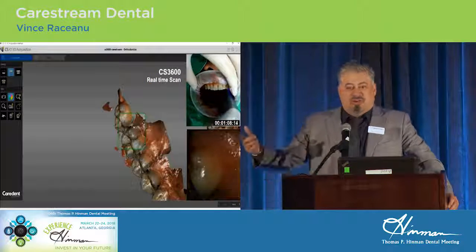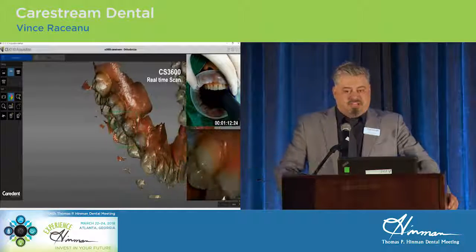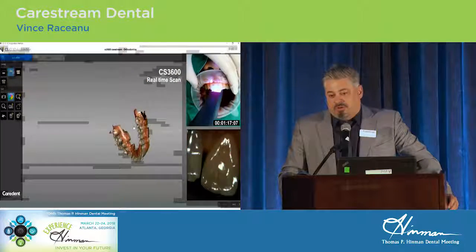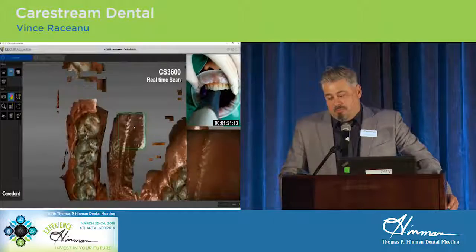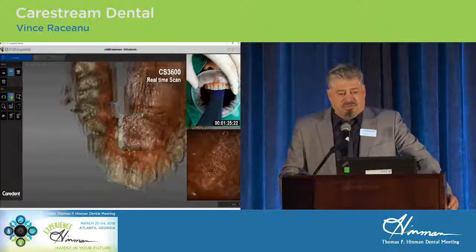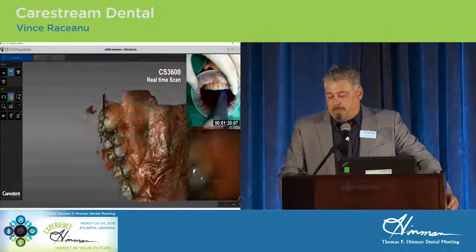So you capture lower, upper, and bite. There are many different ways to scan. You don't always have to do a full arch scan unless it's for an orthodontic type appliance or other multiple units that you're prepping and so on. Palate, of course, if you need ortho. But you can scan for implants, for restorative. We'll talk about all that. There's no limitation as to what it can be used for.